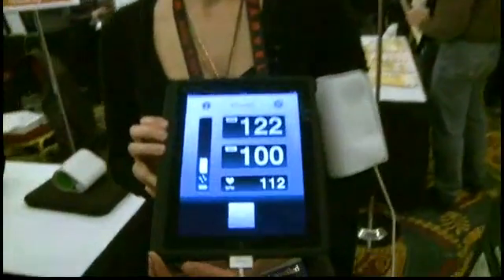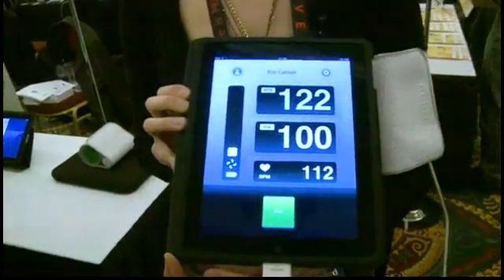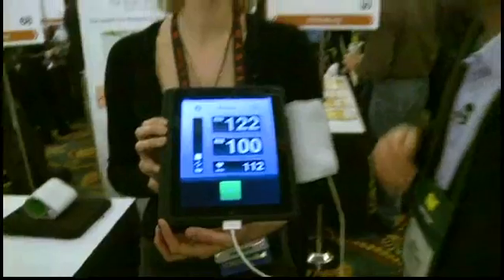So now we know: 122 over 100. Oh, it's not too bad — it's a good one actually. The top one is good. The bottom one... not so good.